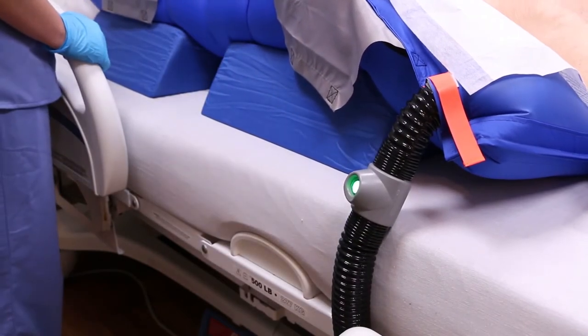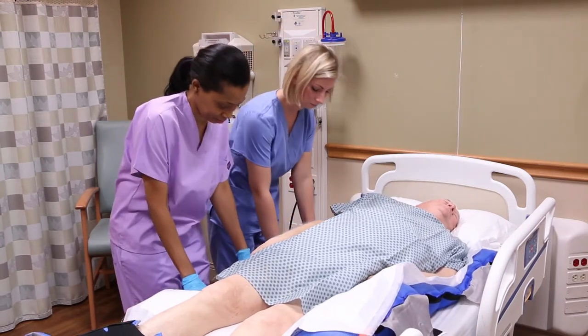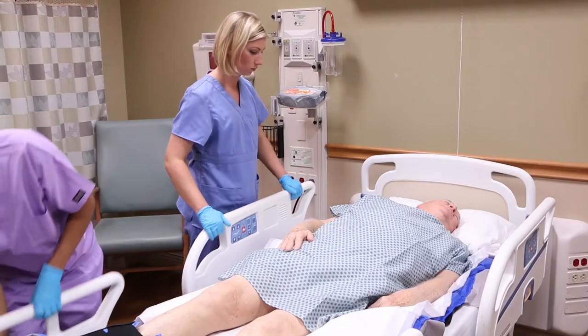If needed, a micro turn can be performed while the glide sheet is deflating to ensure the patient is at the appropriate angle. After deflation, check to make sure the patient's sacrum is offloaded. Raise the bed rails.